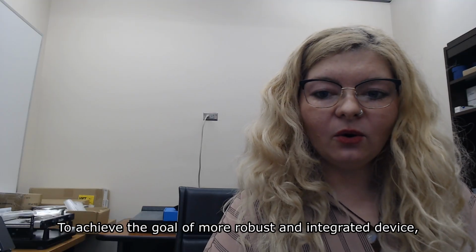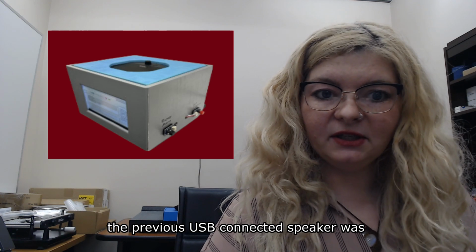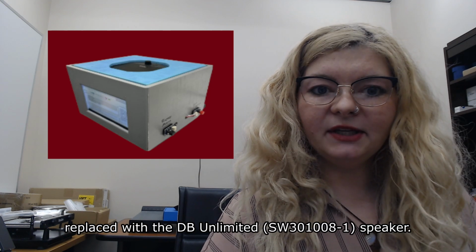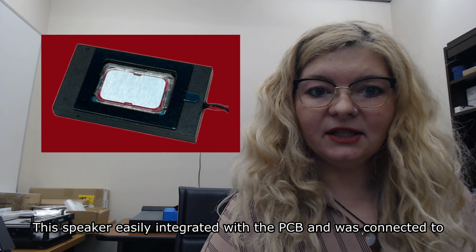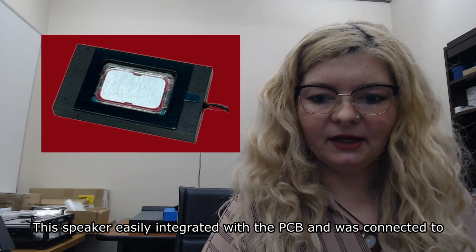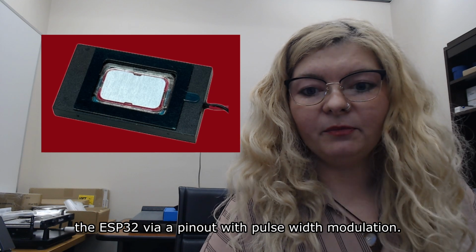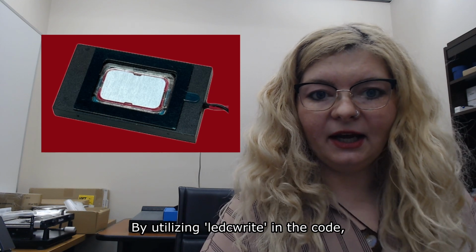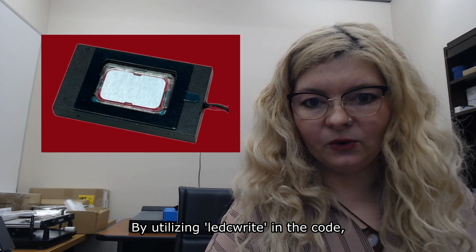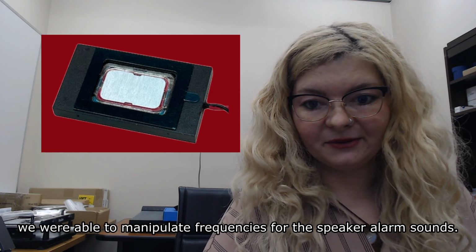To achieve the goal of a more robust integrated device, the previous USB-connected speaker was replaced with the DB Unlimited speaker. This speaker easily integrated with the PCB and was connected to the ESP32 via a pinout with pulse width modulation. By utilizing LEDC write in the code, we were able to manipulate frequencies for the speaker alarm sounds.